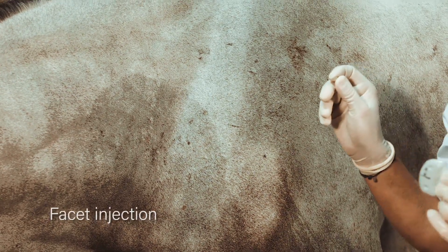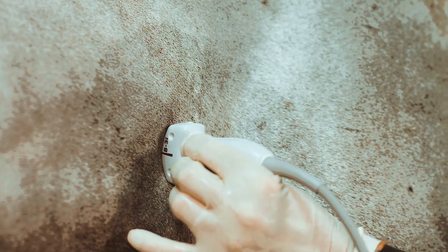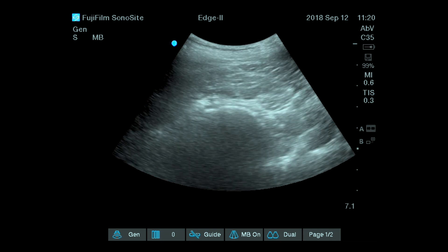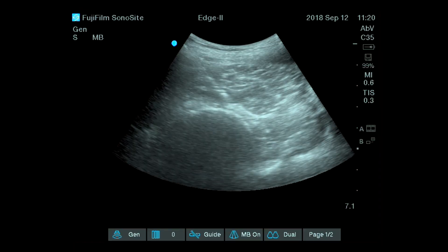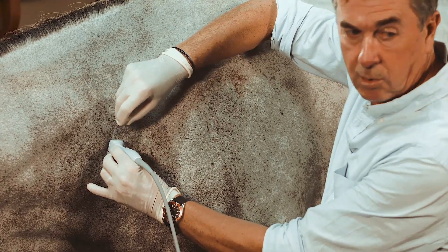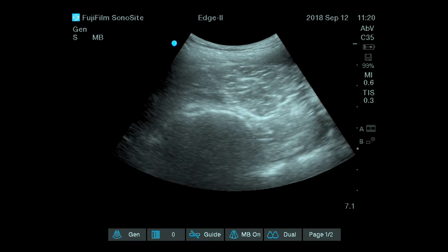Now we are going to show you injection of the facet joints from C3 down to C7-T1. The technique is to put your probe perpendicular to the main axis of the vertebrae. You choose the vertebrae you need to inject and if you get to the point where you see a nice round shape of the facet joint, this is where you want to stand. Keep this in the middle of the screen and put your needle on the top of the probe with approximately 45 degree angulation, then push your needle in order to get exactly at the edge of the facet joint. The needle can be orientated a little bit more steep depending on the probe you use. This probe is very narrow so I can be very close to the edge of the probe and inject here just under the capsule of the joint. When you push the liquid of your injection you might see the capsule showing a light elevation.